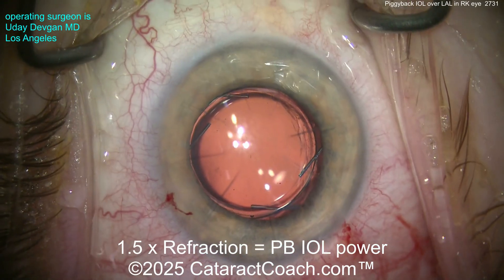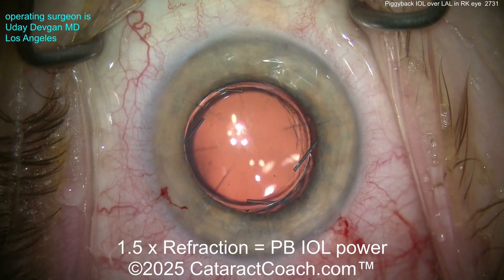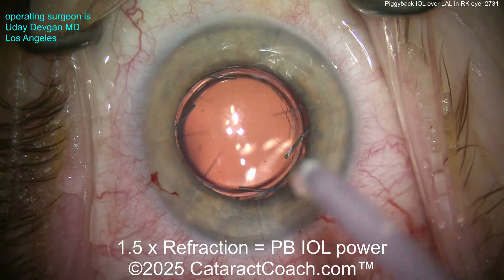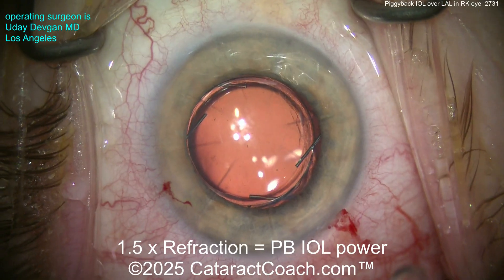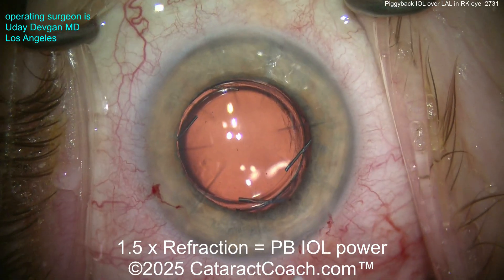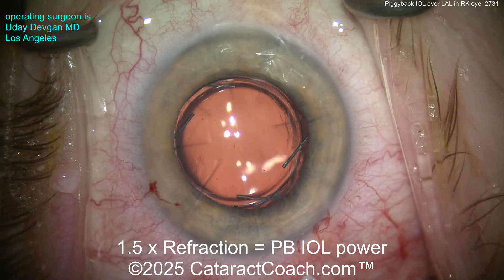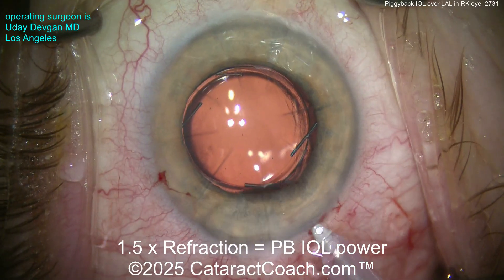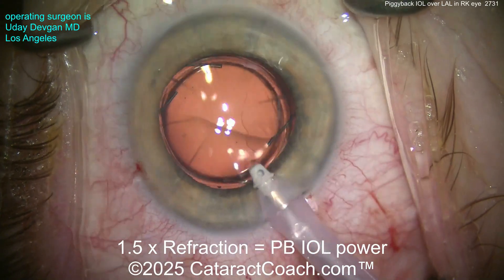Remember, these were all myopic eyes — they had radial keratotomy because they're myopic, meaning long axial lengths and deep anterior chambers. There's plenty of room in the sulcus for a piggyback lens, and the patient can do great.